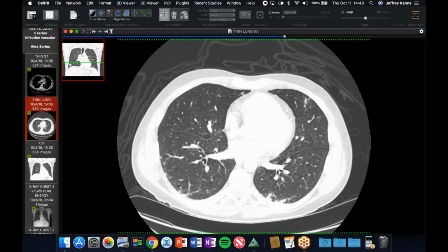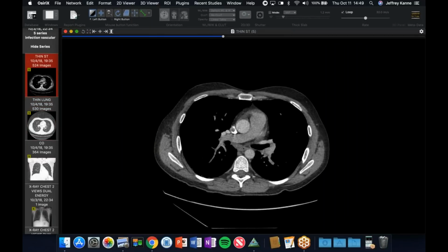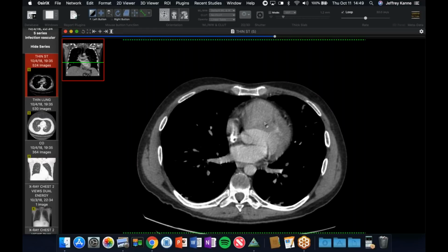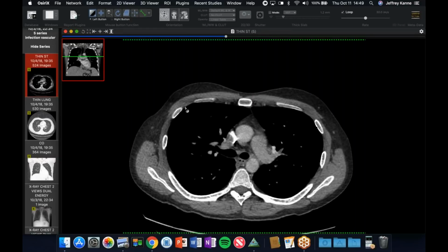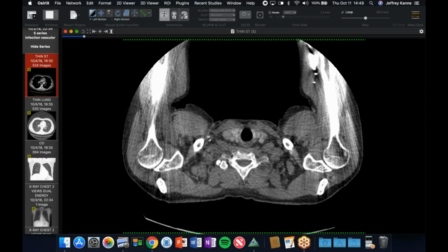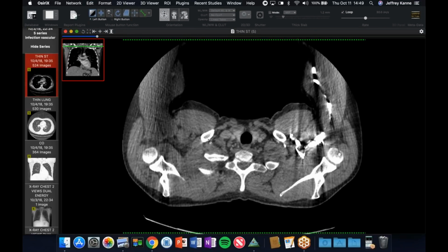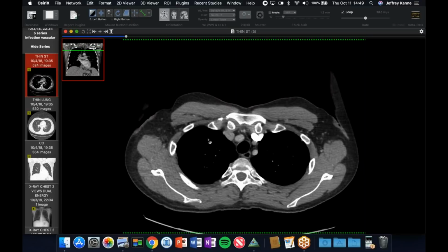But the real exciting part of why I'm showing this is two things. First, if we look on the contrast portion, if you look at the pulmonic valve, there's this large mass, probably the largest vegetation I've ever seen. Oh, you're kidding. Yeah. So there's that. And then, just to make a good case a little bit better, right up here in his vein, you can see this little metal fragment there. So apparently his needle broke off when he was injecting himself, and that's a needle fragment sitting in there, or a little small piece of it.